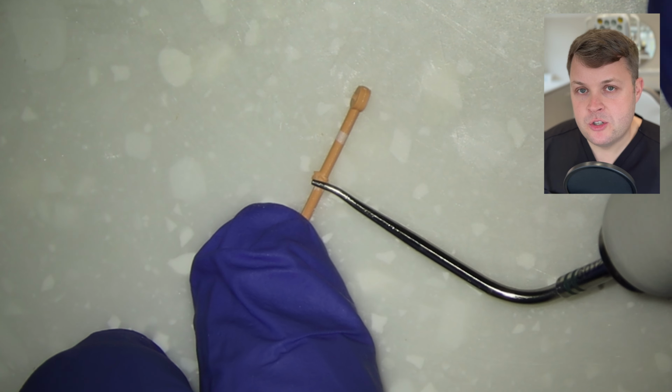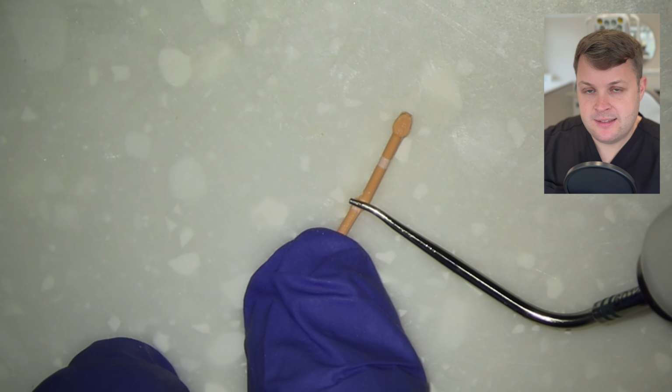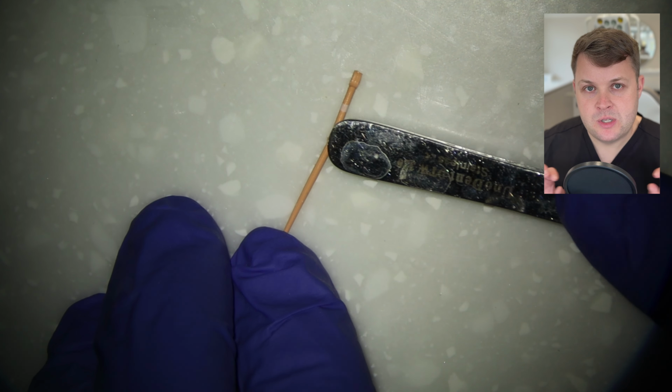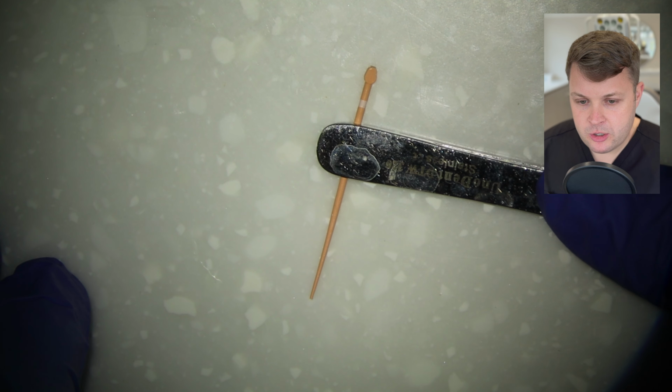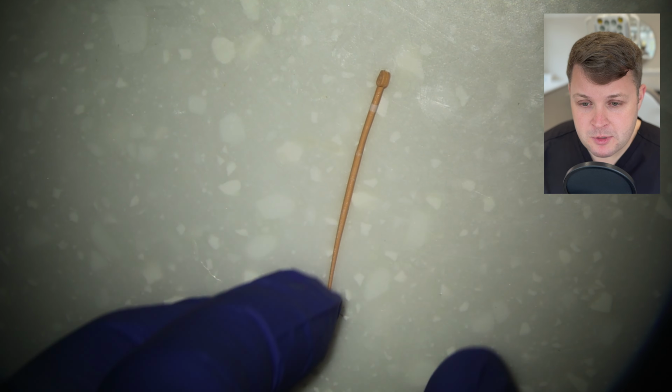But what you do need to do, once you've made sure you've really melted the two pieces together, is roll this GP cone. What I like to use is the back of a pair of tweezers. Give it a good little roll there. Make sure you bring it together, and you can see now that the join is almost imperceptible.